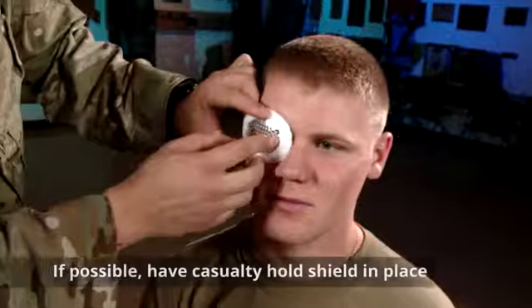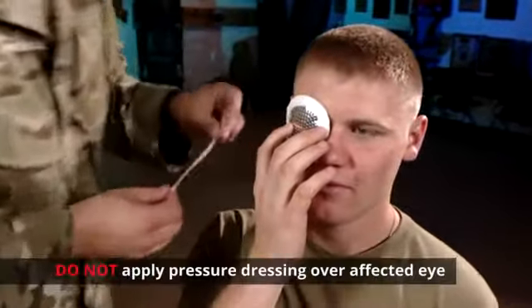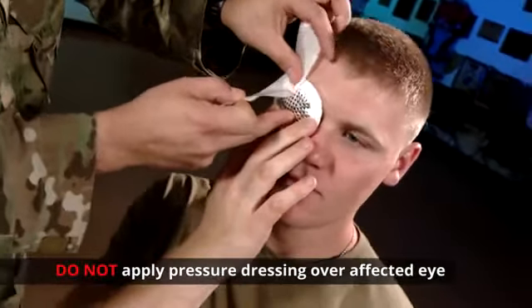Please hold that in place. It is important to not apply a pressure dressing over the affected eye.